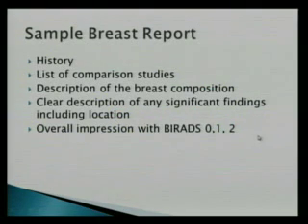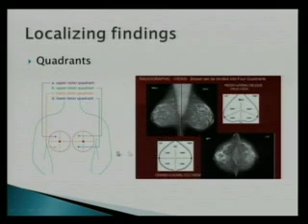Every mammogram has to have a BIRADS at the end. So that's the biggest thing. Give a 0, 1, or 2 and sign it, move on, or save it, move on. So this is just helping talk about localizing findings.